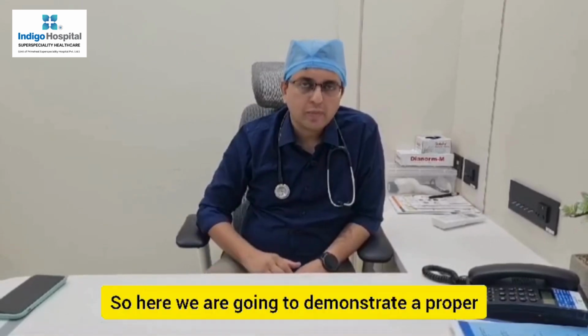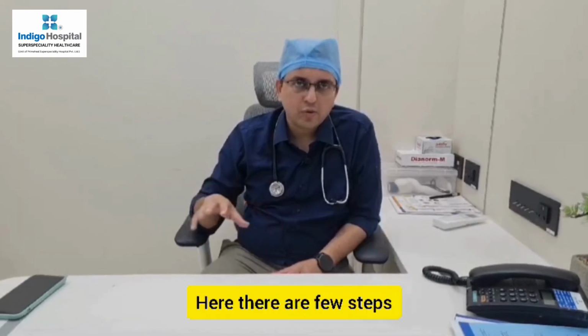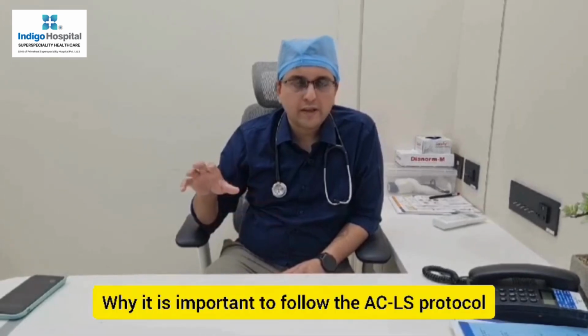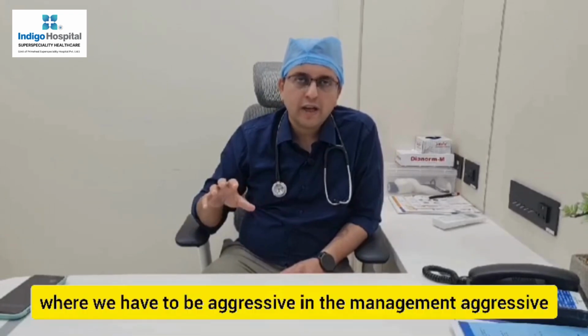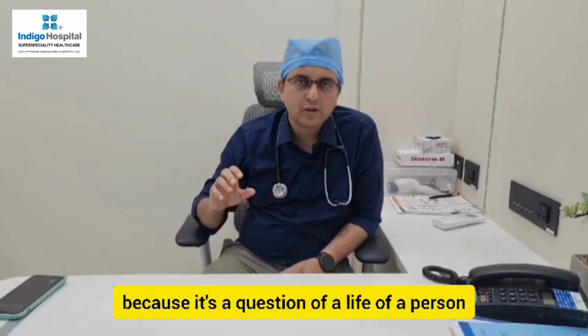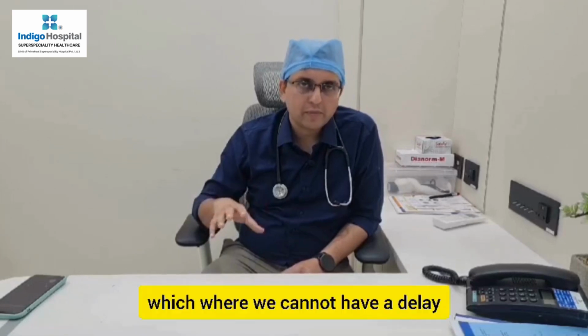So here we are going to demonstrate a proper ACLS protocol, advanced cardiac life support for cardiac arrest. There are a few steps which we need to follow. Why is it important to follow the ACLS protocol? Because cardiac arrest is a situation where we have to be aggressive and coordinated in the management, and immediate management has to be there because it's a question of a person's life. That is the only situation in the ICU where we cannot have a delay.